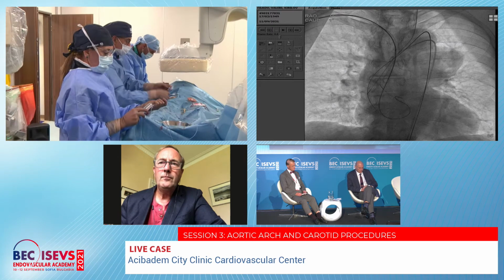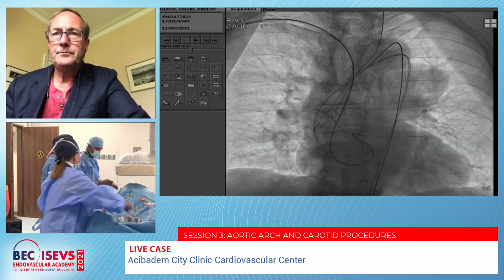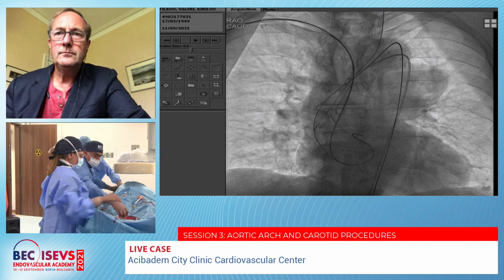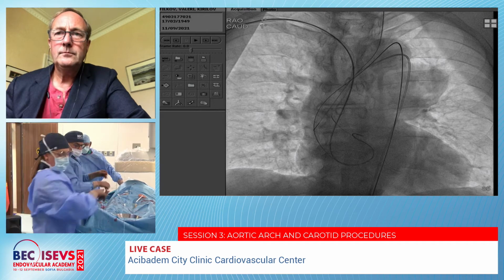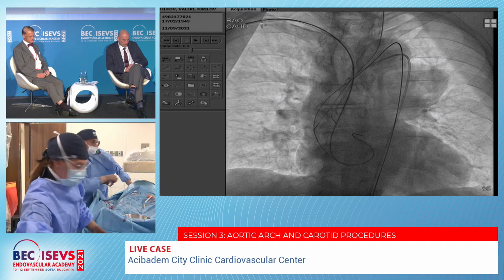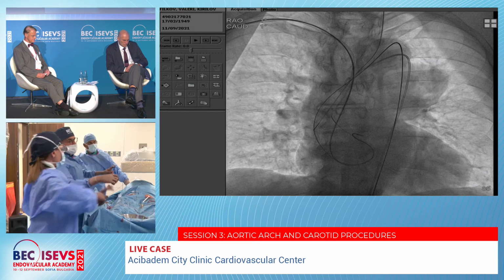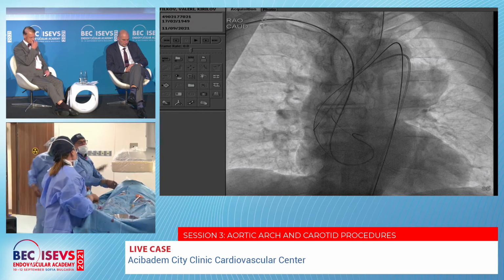Can you tell us what kind of stents you intend to use for the chimney and what kind of stent graft you're using for the arch? Yes, definitely. As I commented during my presentation about the chimney intervention for the arch pathology, we are intending to put Endurant. It's in fact a stent graft from Medtronic that is utilized.